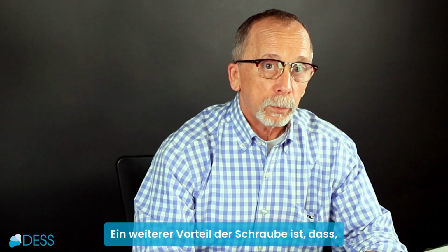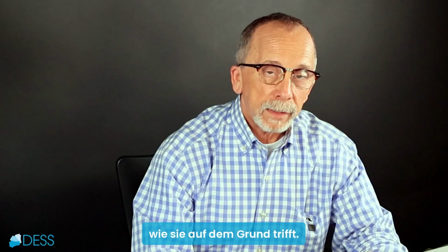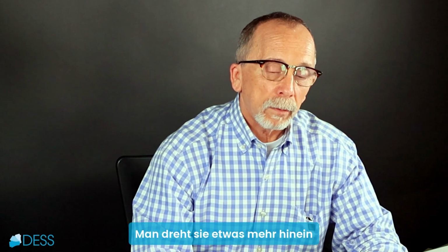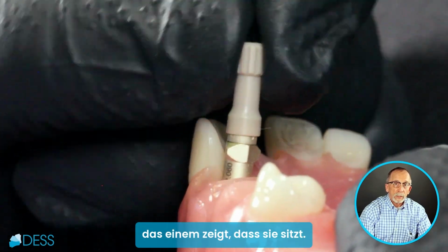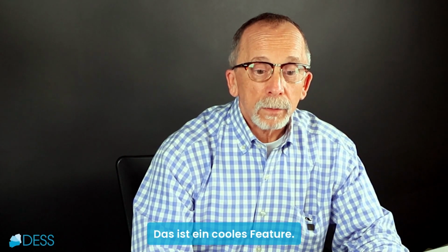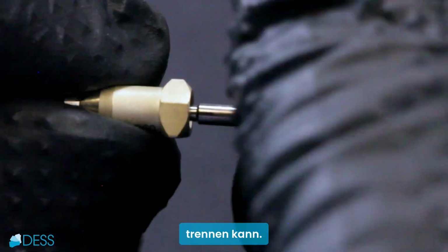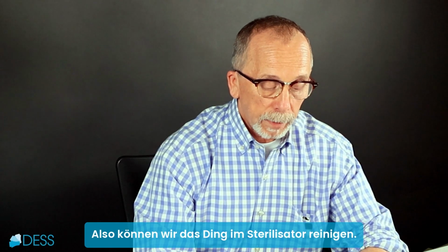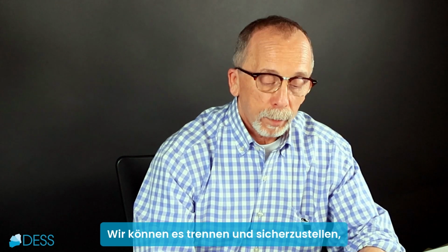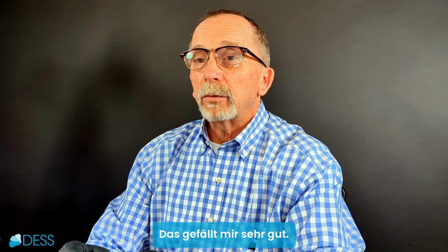The second thing about the screw is when you put the screw in and start turning it, you start to feel it hit the bottom. It goes a little bit longer and the screw actually has a very noticeable click that tells you that it's fully seated. You can feel it, you can hear it. That's a pretty cool aspect of the screw. The last aspect of the screw that holds the scan post in that I like is the fact that the screw can totally separate from the body. So we want to throw this thing in the steamer to clean it, and we can totally separate it to make sure all the bacteria and stuff out of the middle of the post is out there. I really do like that aspect.